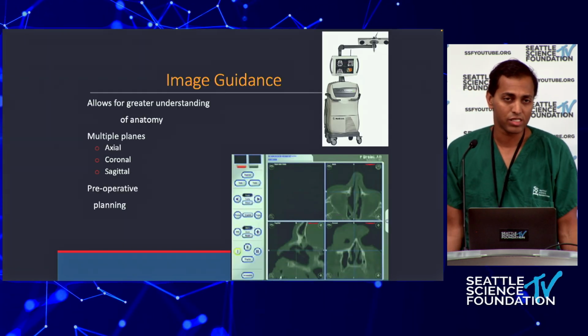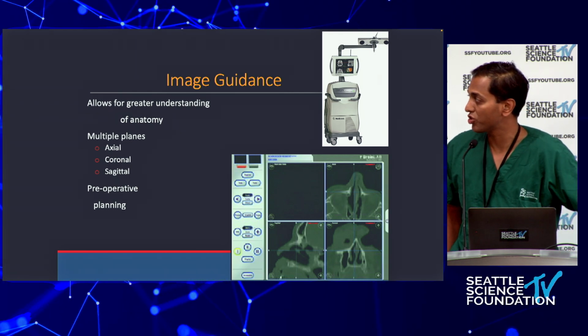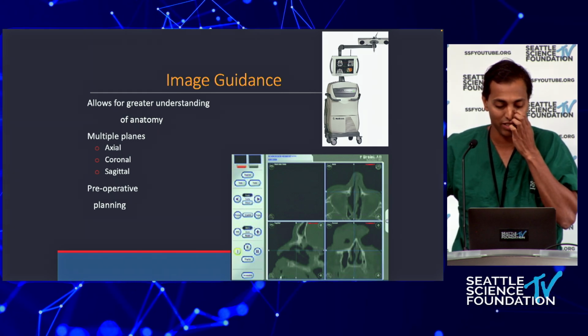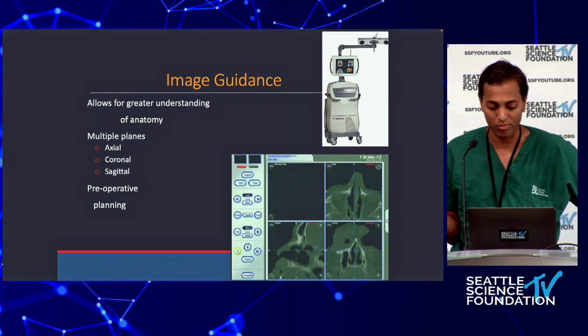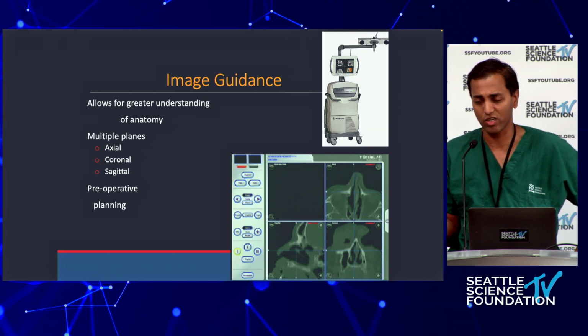A word about image guidance. I use this for all my frontal sinus surgery. It makes me a better surgeon. The big thing for me is, and I've consulted with all the image guidance companies at some point, and they all say they're always 100% accurate, and I think we all know they always have some sort of errors here and there. So I don't use it for any actual reliance on how to get in the frontal sinus.